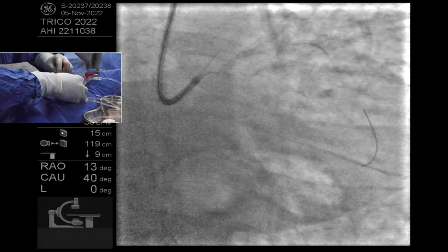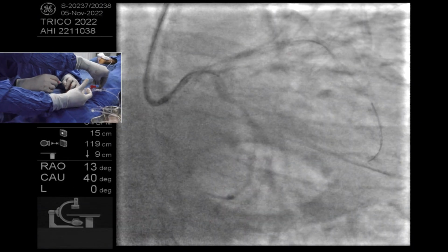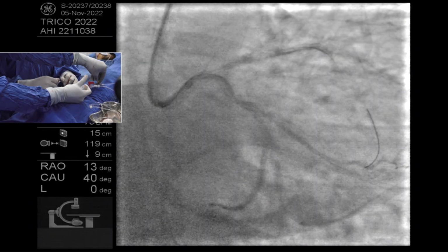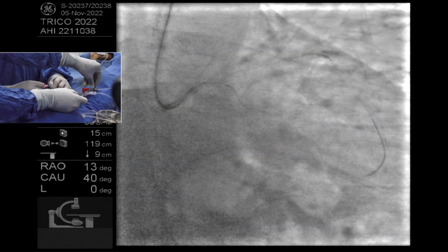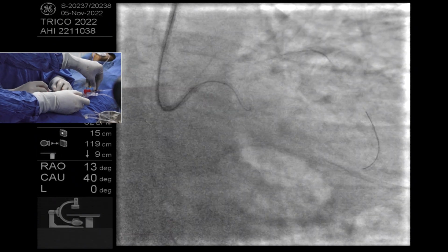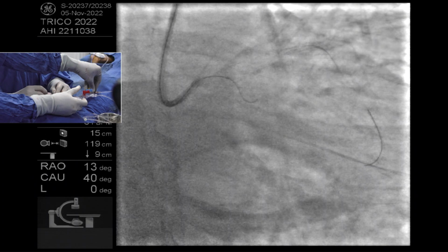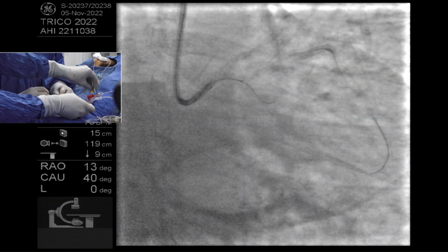Sometimes, injecting Rotaglide into the guide catheter into the circumflex, it's a crazy idea, but since we don't have a lot of choices, it might be a last-ditch effort. Could you elaborate on that? The rotablator lubricant that is there, there have been descriptions for tracking balloons and stents when you're stuck, when nothing is going. Although now the Gaia is entering, so it's a hopeful thing.